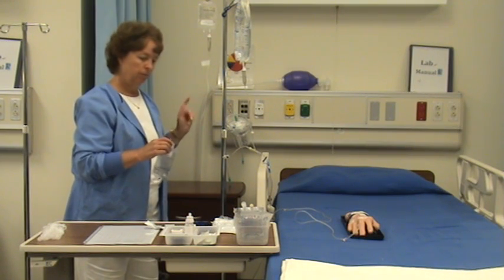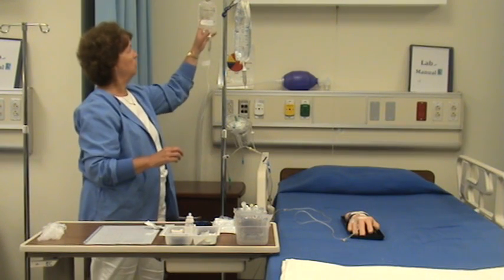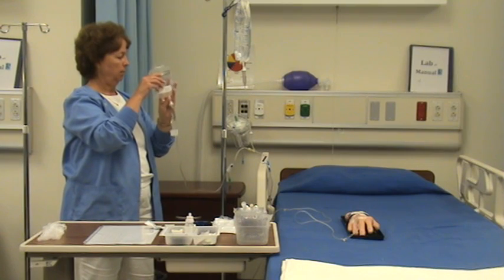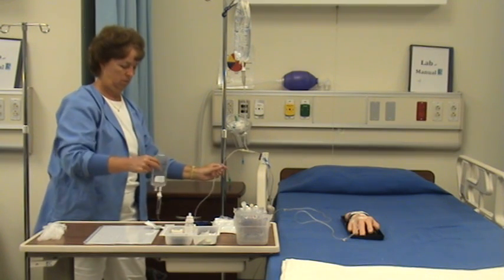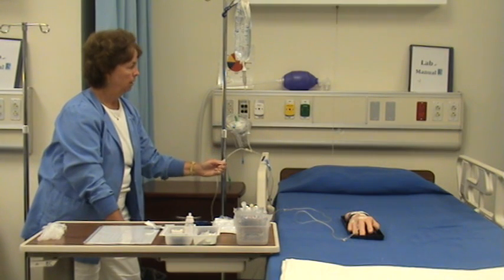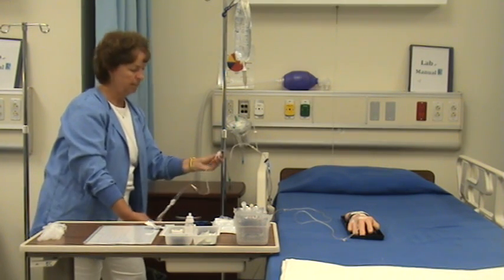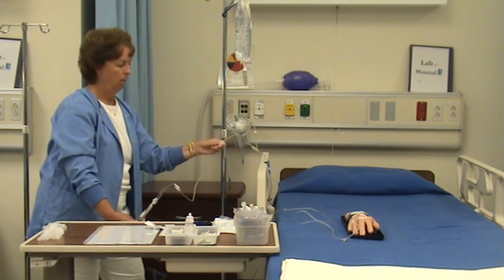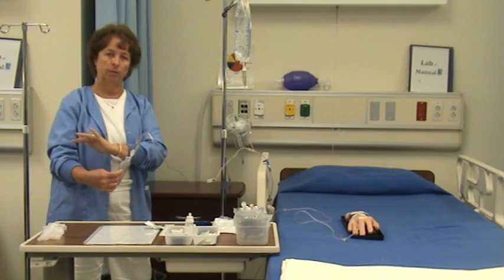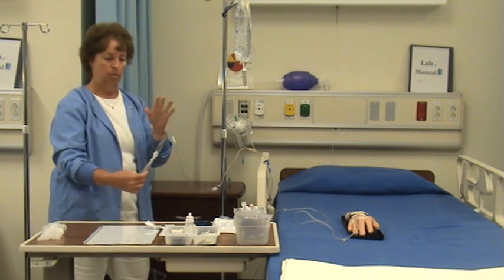What I'm going to do first is back prime the tubing. So I'm going to take the tubing on the secondary, hold it down low, and open this all the way up. And if you see that, I don't know if you can see it on the video, but it's full blast. It's basically just flushing out this IV line. Once it's flushed, I'll close it. So now I have all the IV fluid in there, which is compatible with whatever I'm going to hang next. That's important. It has to be compatible.